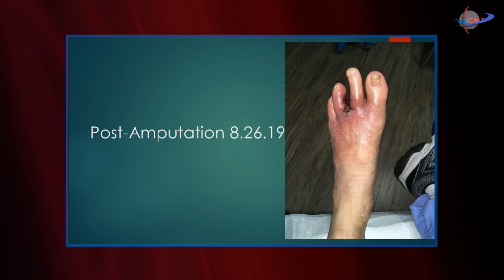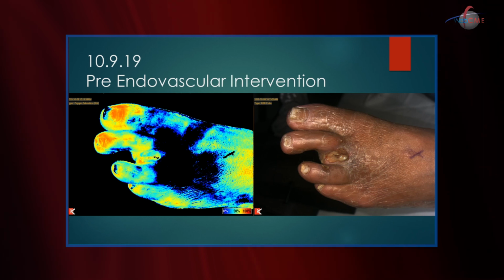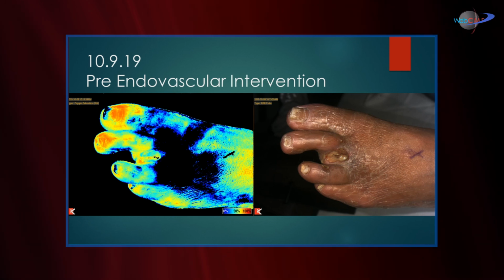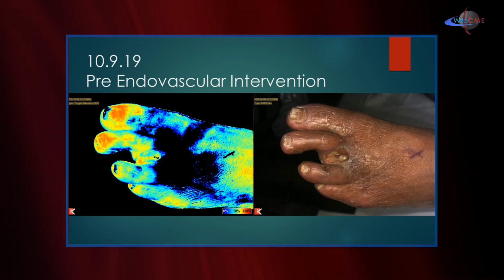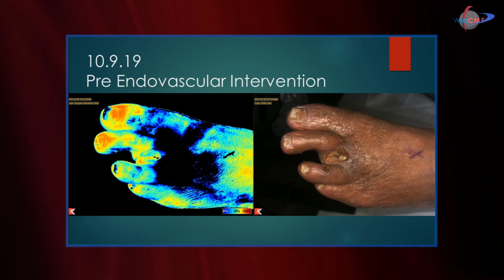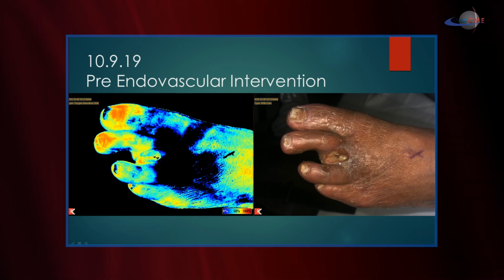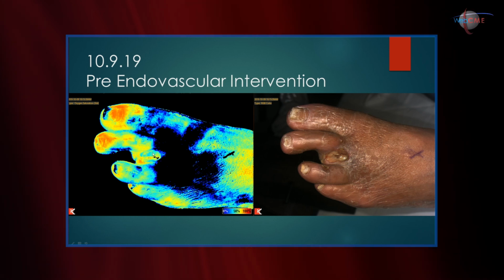Jonathan obtained a Kent image, a near-infrared spectroscopy image. Jonathan, want to explain that technology just a little bit? So near-infrared spectroscopy is an up-and-coming technology that is utilizing the difference in deoxygenated versus oxygenated hemoglobin. Deoxygenated and oxygenated hemoglobin both reflect different wavelengths of infrared light, and this camera captures that and measures the difference between them, and then presents us with this image that you see here, this full color image. So here you see on the right the patient's digital image, what we typically use for clinical management. And here you see a near-infrared spectroscopy image.